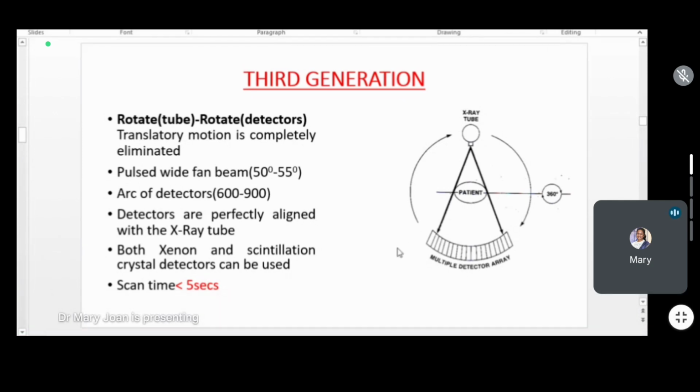That is called a pulsed beam. We get it in pulses. So if it is a continuous one, then we will have a sinusoidal spectrum, and if it is fixed, then we will have spectral lines type. Understood? Yes, ma'am. Okay.